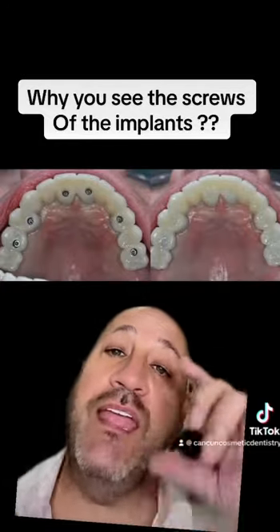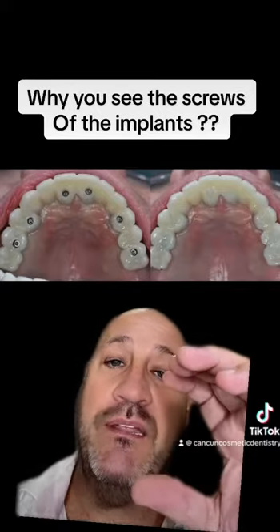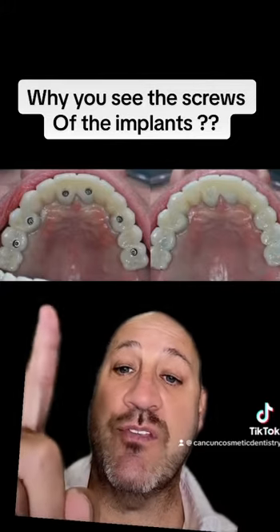...that means that the interconnection that you have between the bar and the implant cannot be done. So with that, you will have an interconnection where you can — you see there are screws there.